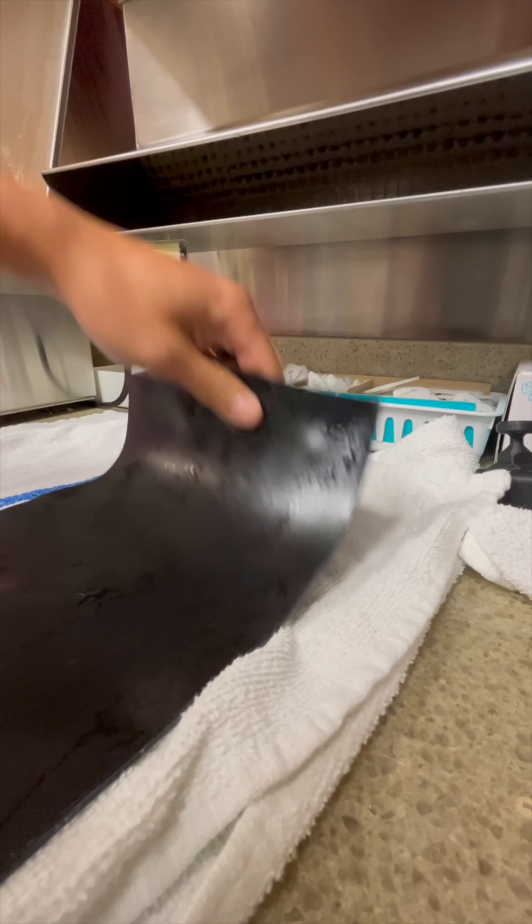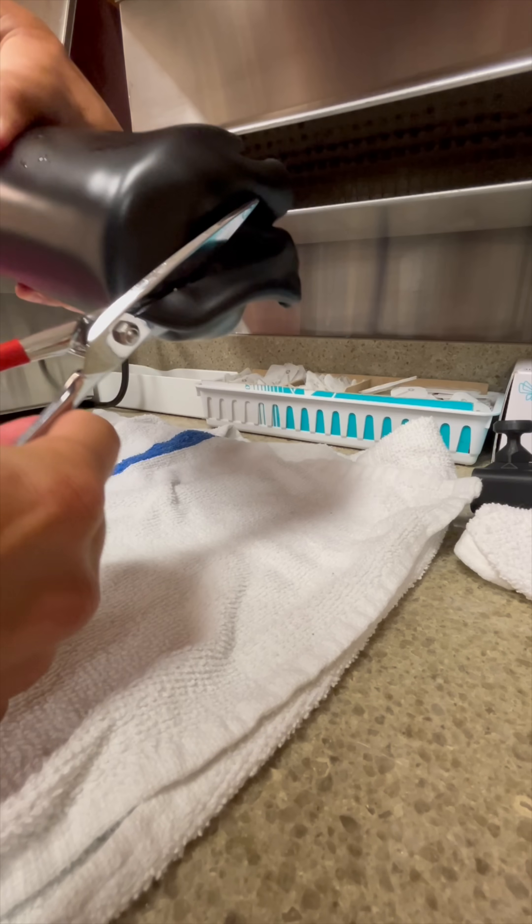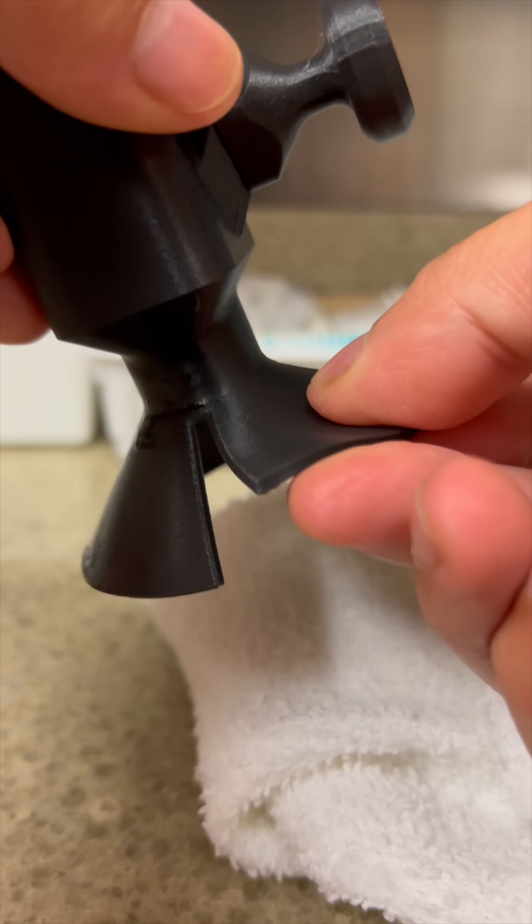Thermoplastic is formed around the residual limb and strapping is added later. The base can be heated up, molded, and glued to the arm piece.